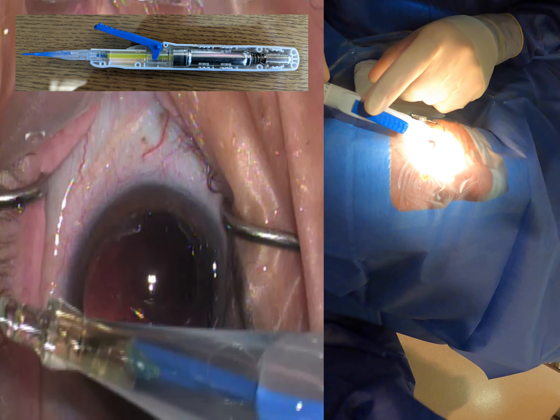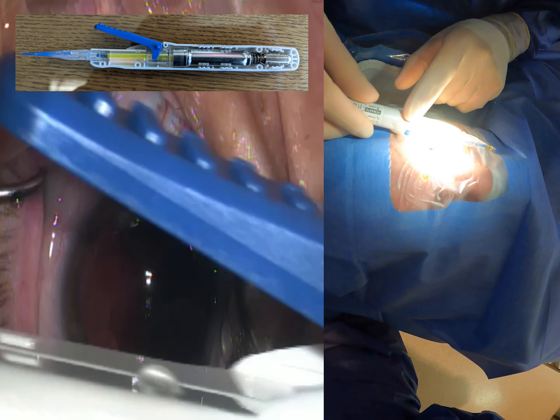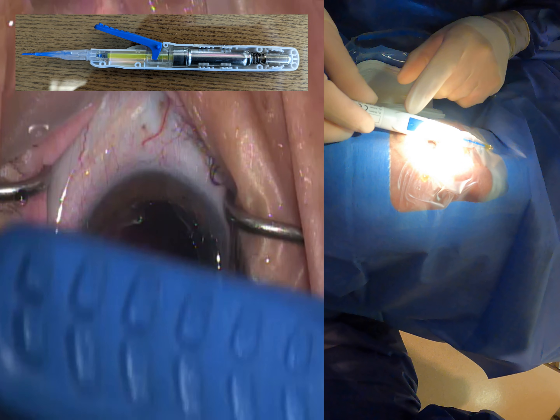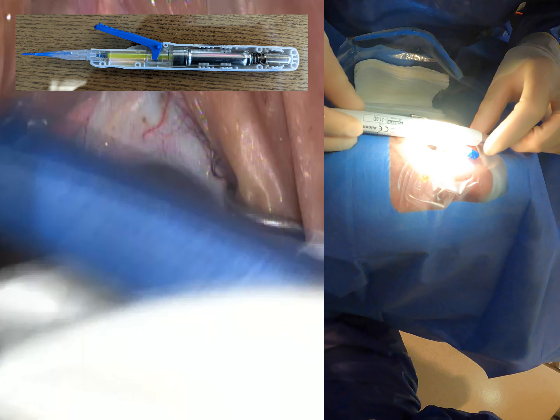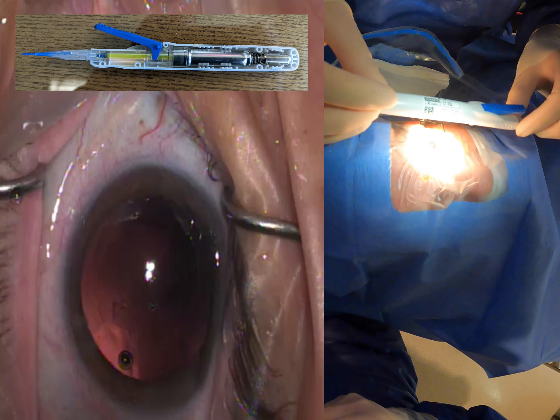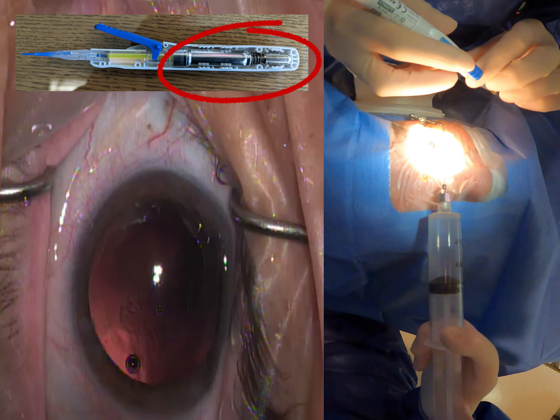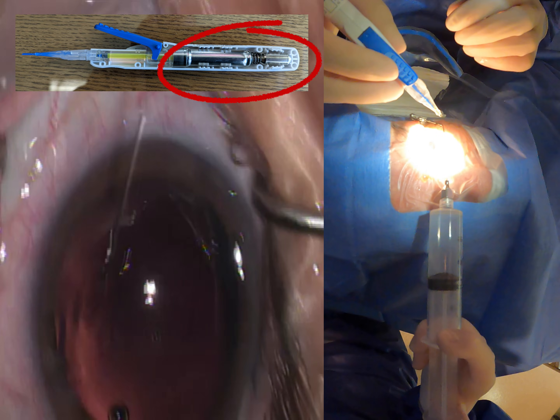This is the new Clarion lens from Alcon — this is the auto-injector it comes in. Here's that blue lever; this is what you're going to push down to inject that lens inside of the eye. It's kind of a larger injector but feels really nice in the hand. There's a CO2 cartridge built into it, which is why it's a little bit bigger — that's what gives it that smooth, nice injection.